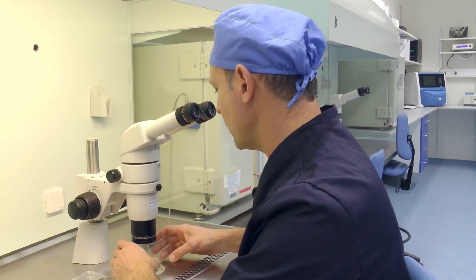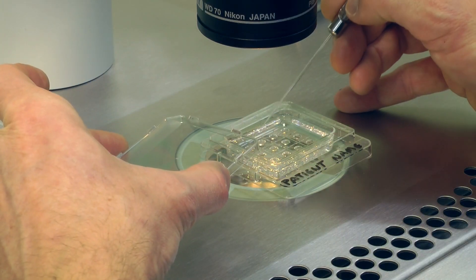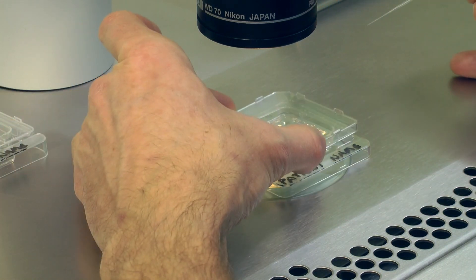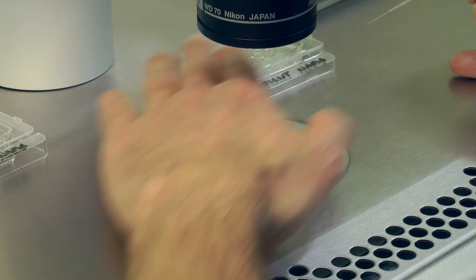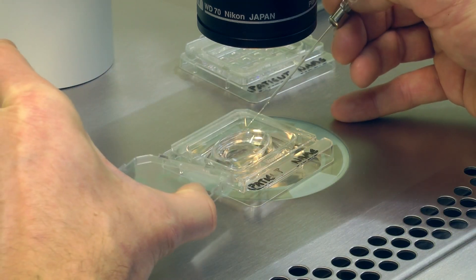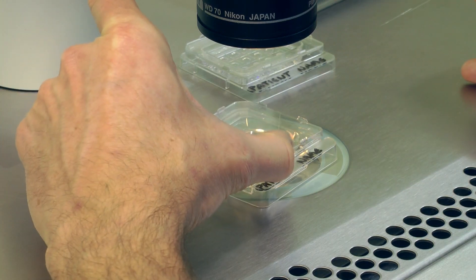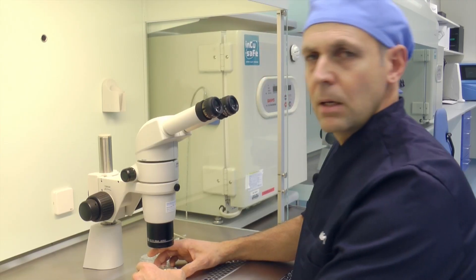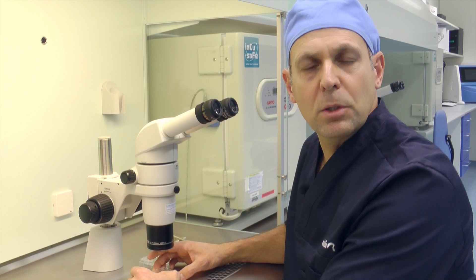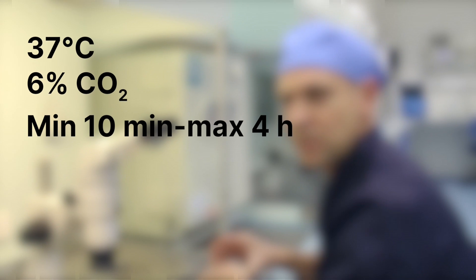On the day of the Embryo Transfer, move the selected embryo from the culture dish and place it in the pre-equilibrated Embryo Glue dish. The embryo should be placed in the Embryo Glue dish for a minimum of 10 minutes and up to 4 hours prior to the Embryo Transfer.